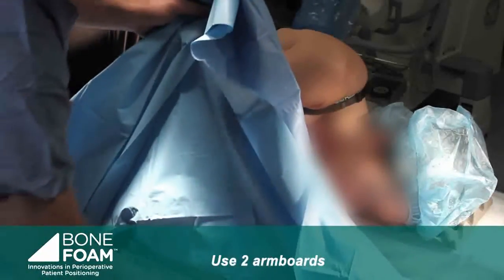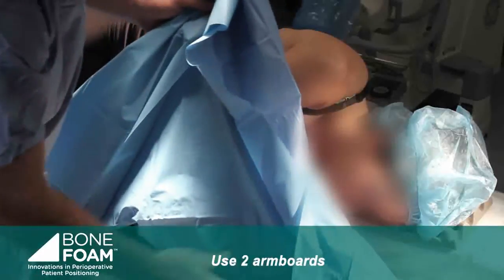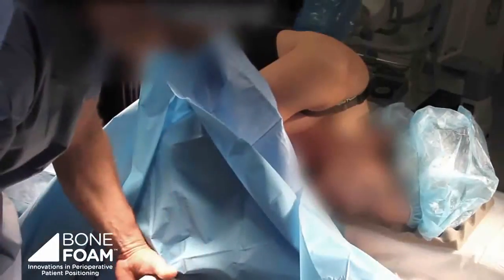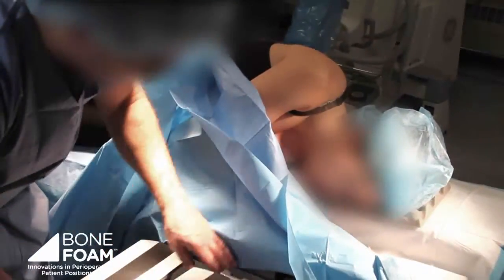One can either use a hand table or these two arm boards side by side. Ideally, it is better to use something radiolucent so that you don't compete with any of the metal that might be in the arm boards.